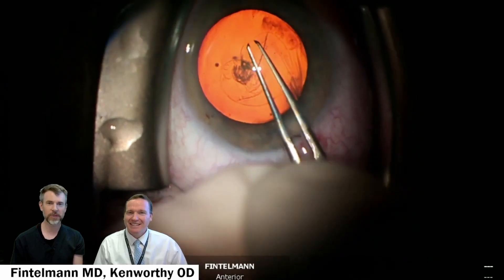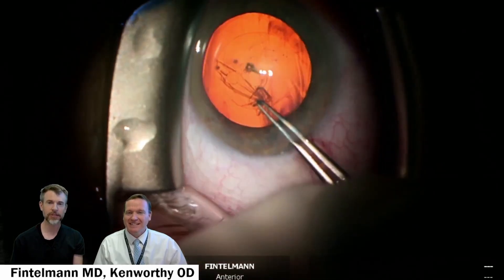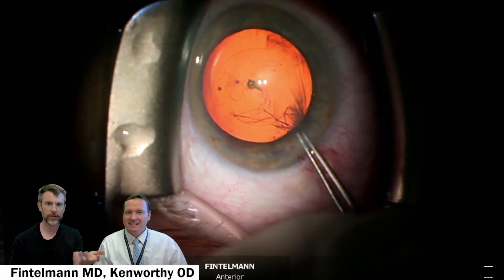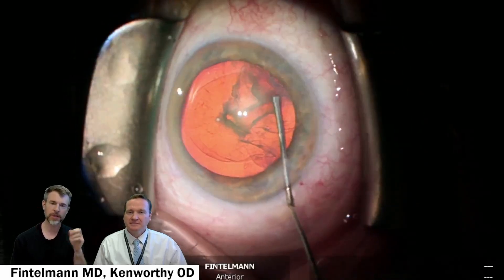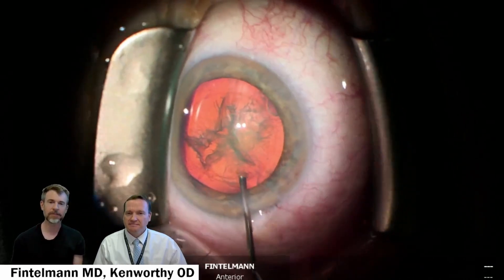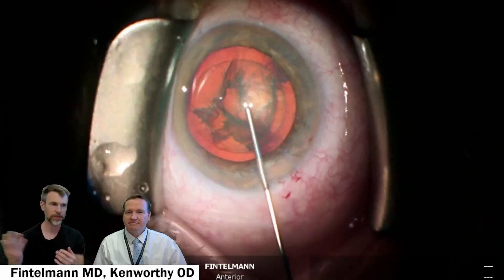Somebody asked me how many I've done, and I think I'm close to 10,000 now, and it took a long time to get it just right. I hear a lot of questions on laser-assisted cataract surgery, and there are certain things it's better at — it's more reproducible, more precise capsulorrhexis — but it doesn't have any impact on the outcomes, meaning the final vision. The final refractive outcome is not affected whether you do manual or laser.